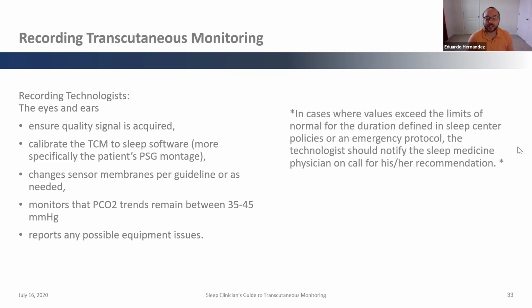But yeah, this is something that's kind of a no-brainer, but it's important that people understand that transcutaneous isn't just a value on a recorded sleep study. It's not just in the report and that's it. It really does depend on the acquisition technologist to assure that that signal is as valid as possible.